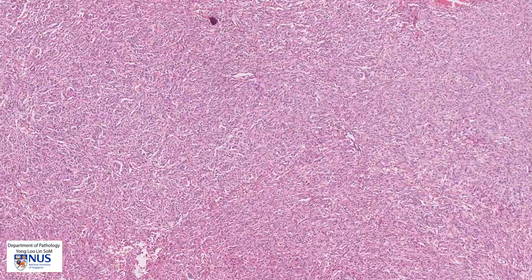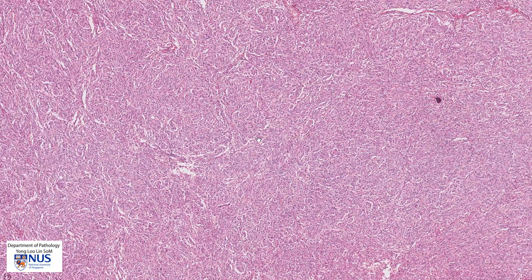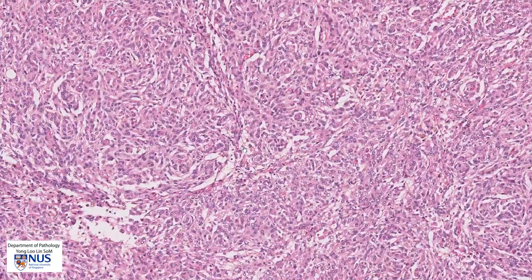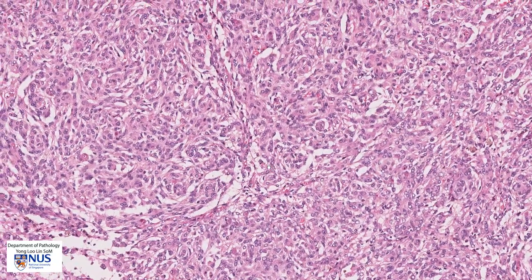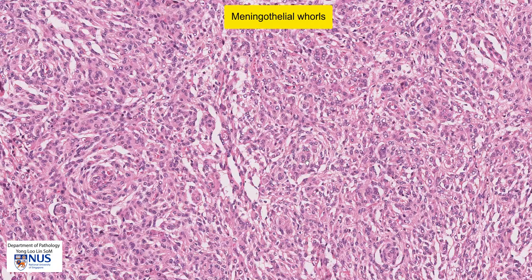Going back to lower magnification, we also get the feeling that there are some kind of rounded arrangements of cells. These somewhat whirly structures are known as meningothelial whorls, and we can see some nice examples here.